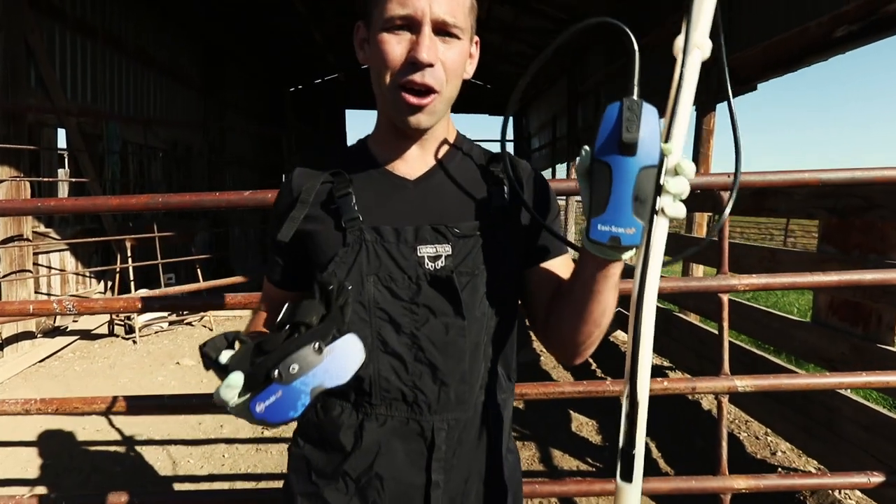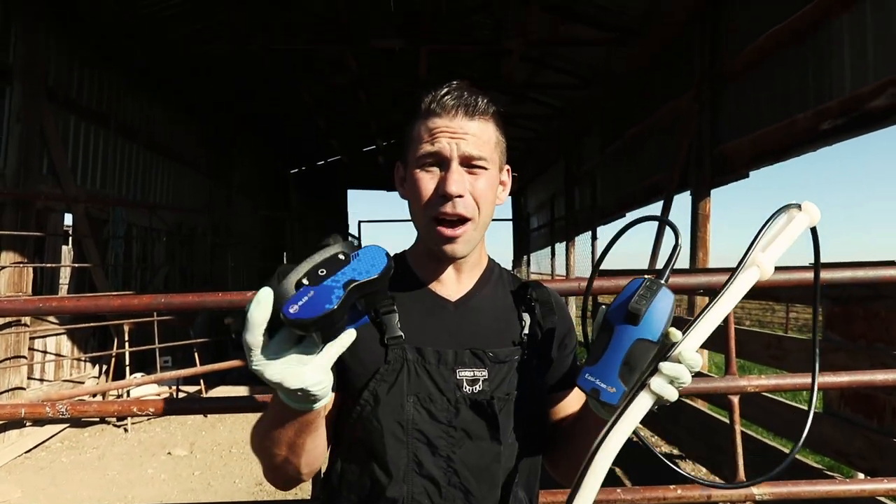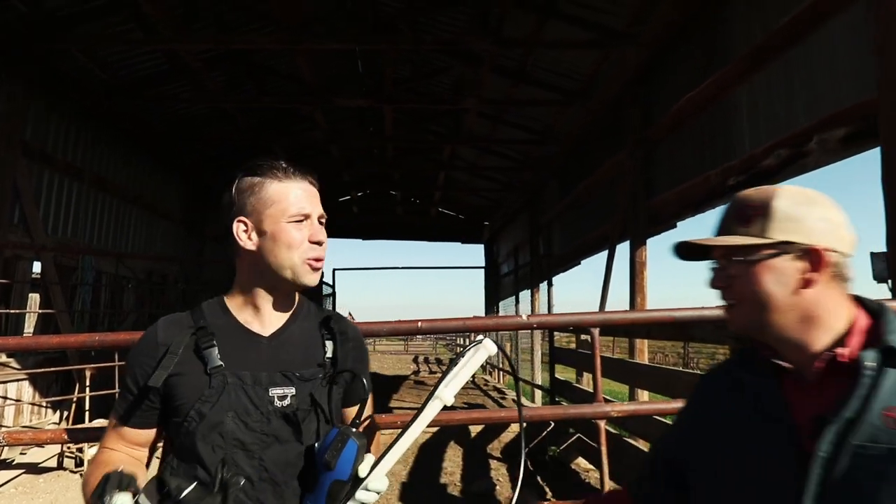This is the Easy Scan Go, this is the Bugs Go. If your CalVet isn't using an ultrasound, they ain't no CalVet. I just used my arm. You can't handle the truth.